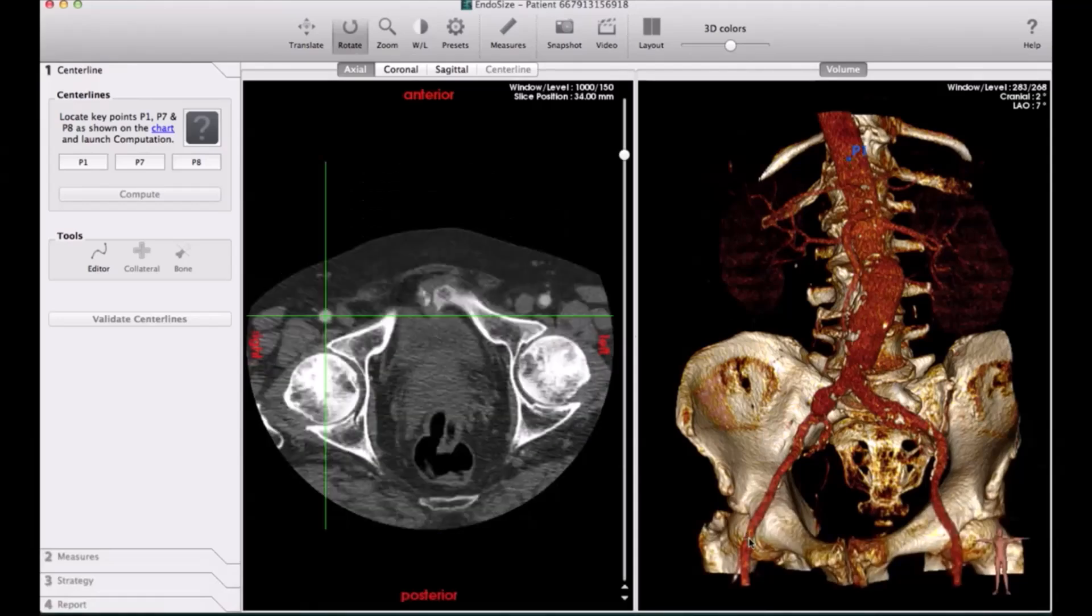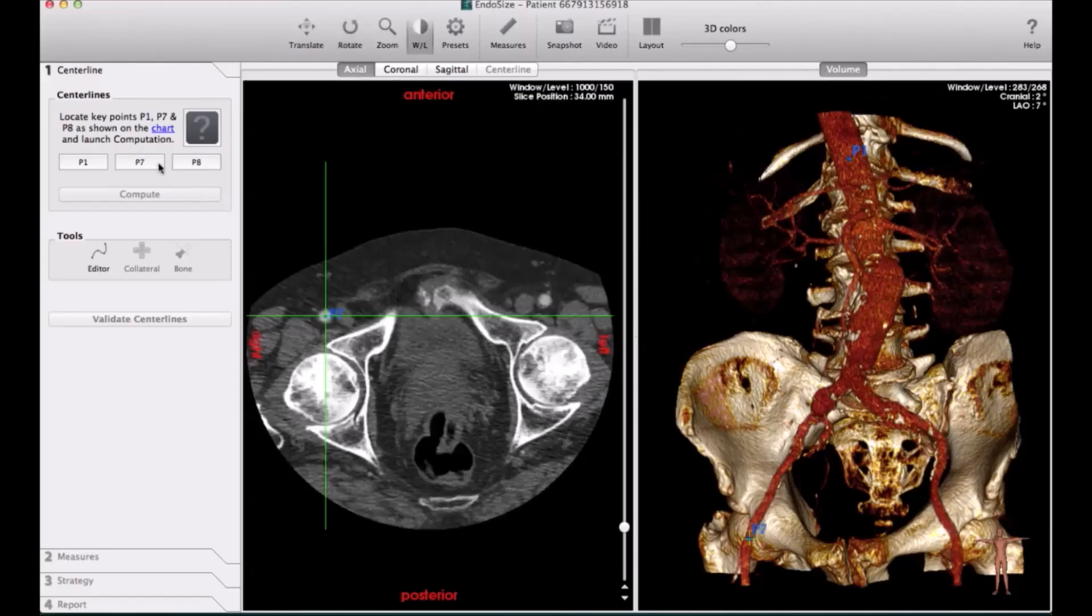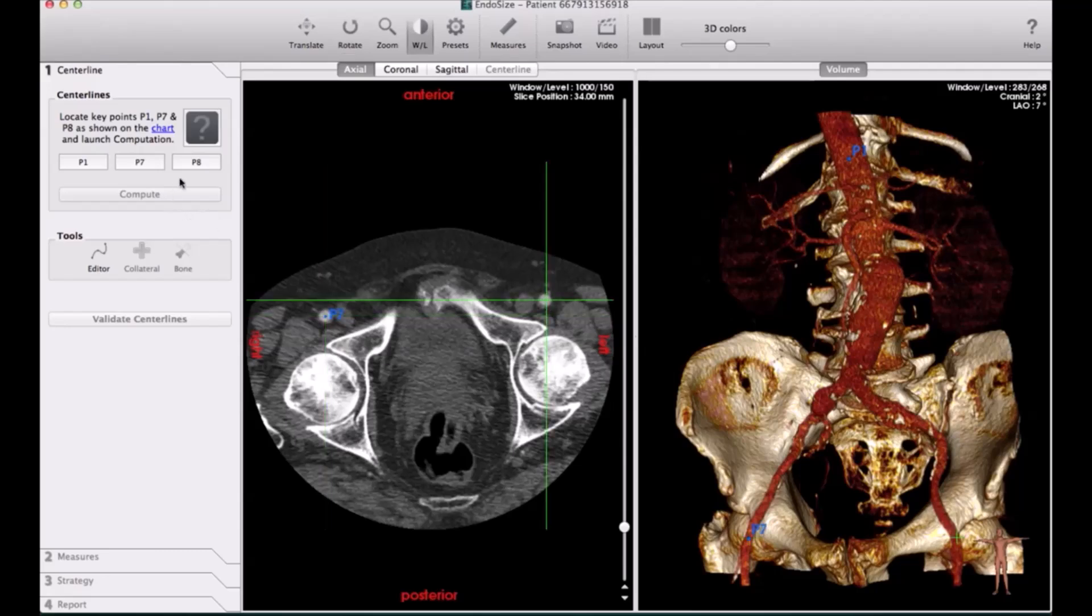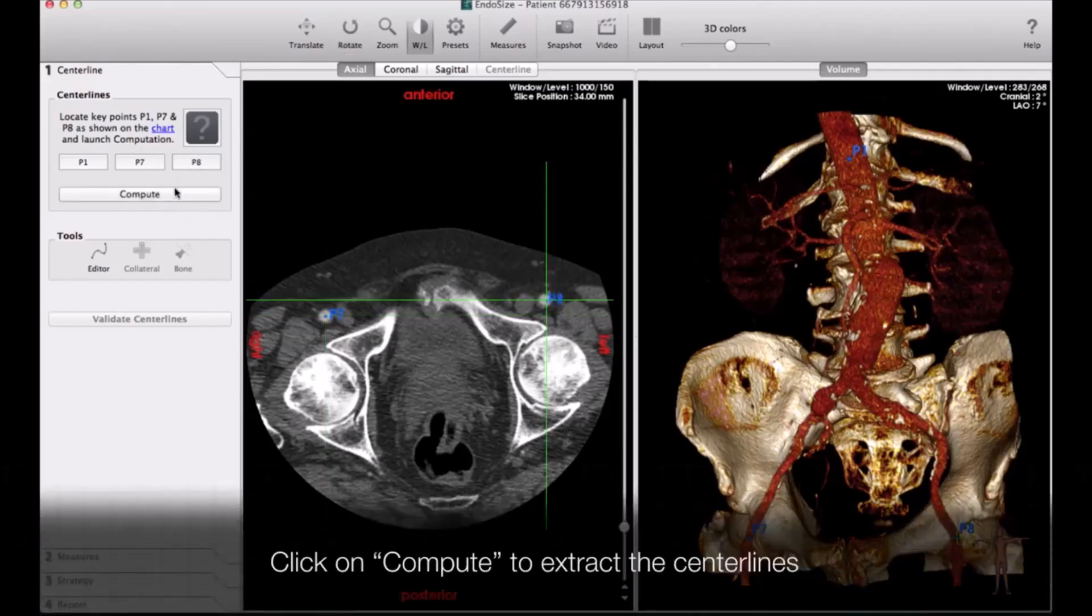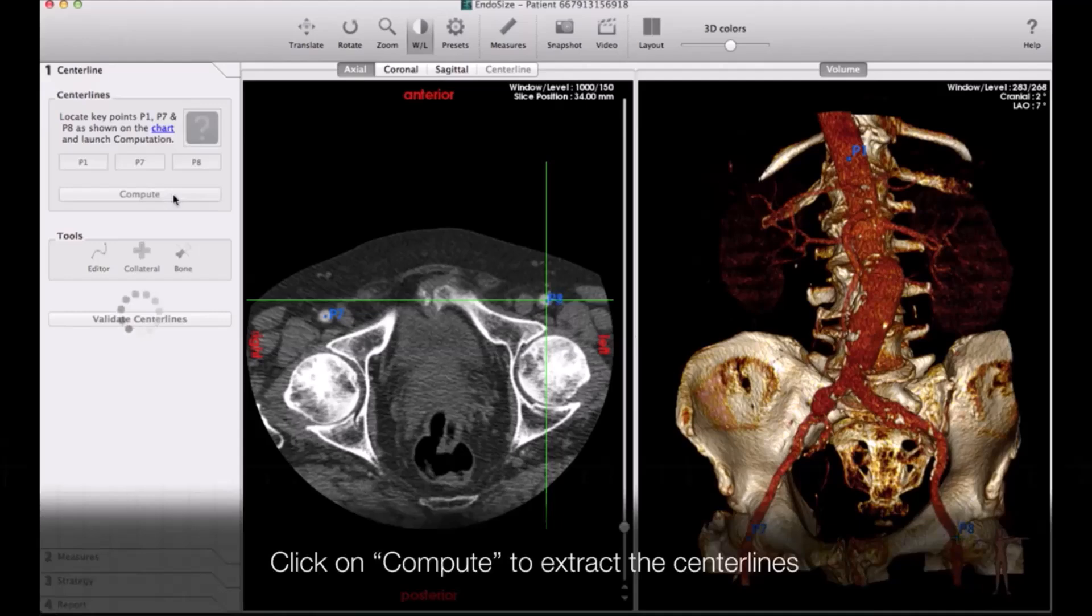After that, you can adjust the measurements. You can adjust right and left common iliac, maximum transverse diameter of the aneurysm, and so on.